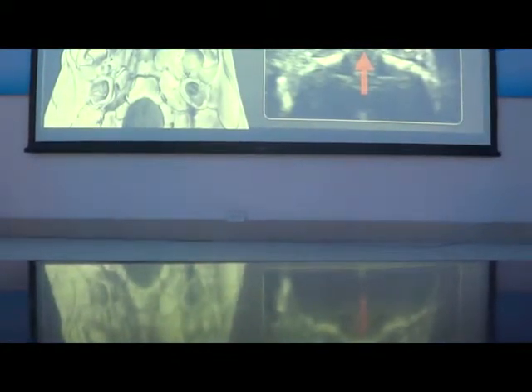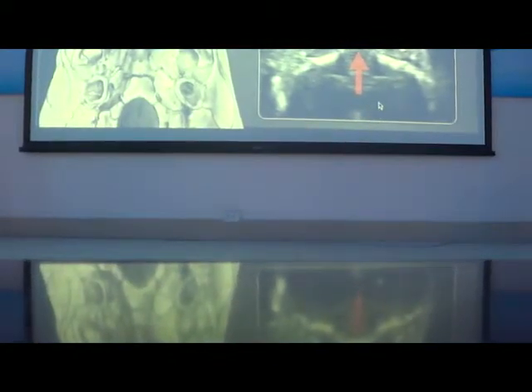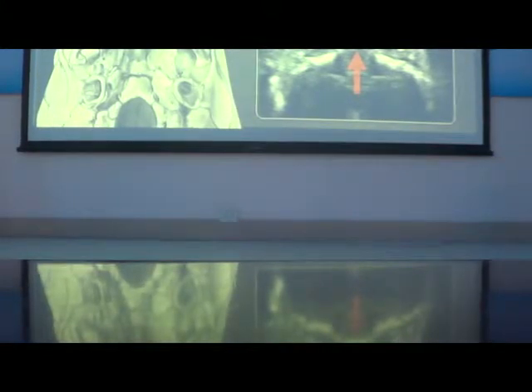If you want to look at the palate, the best is to use 2D, not 3D, and to start with this position, a transverse 2D section.